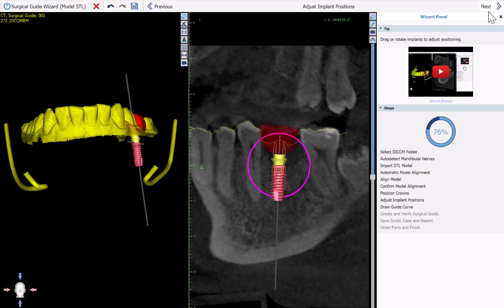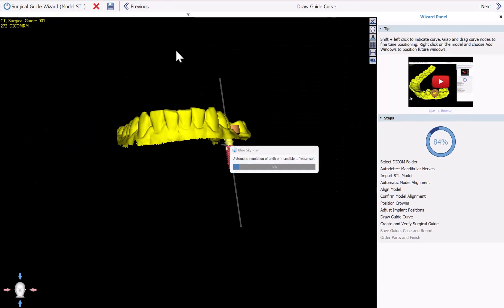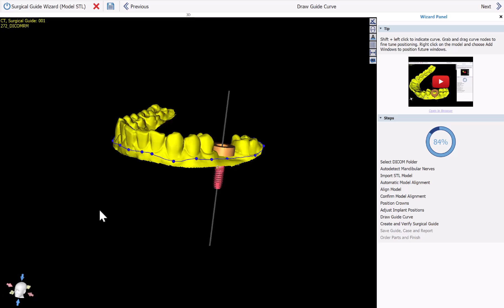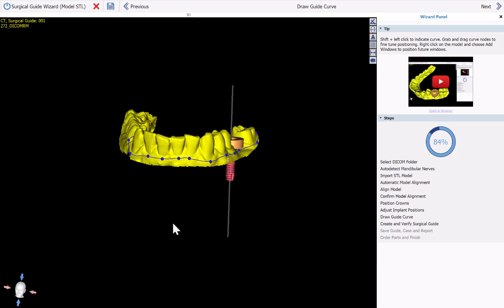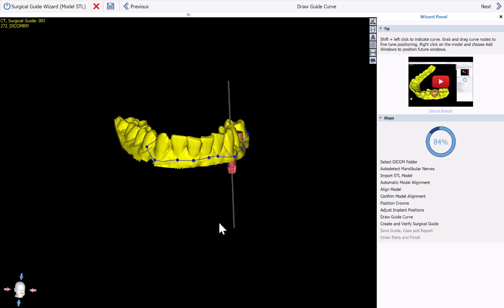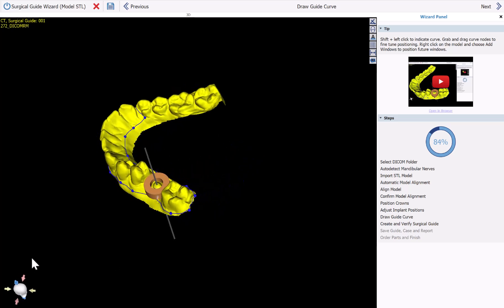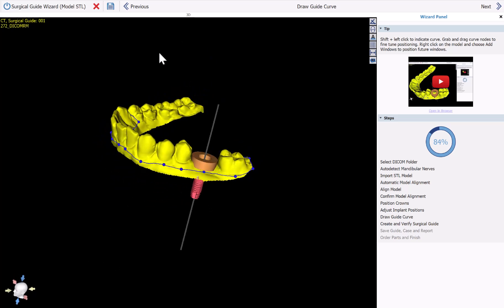I'm going to now click Next, and what we see happening is the software is going to draw the surgical guide curve automatically. The curve appears on the screen — we can confirm and fine-tune as necessary — and once that is done, click Next.